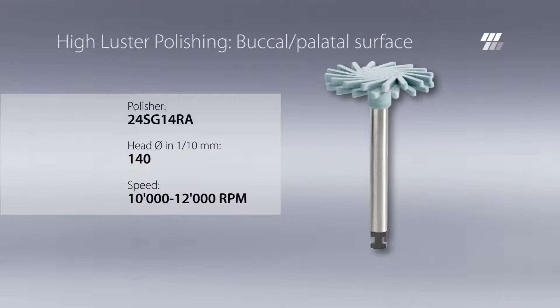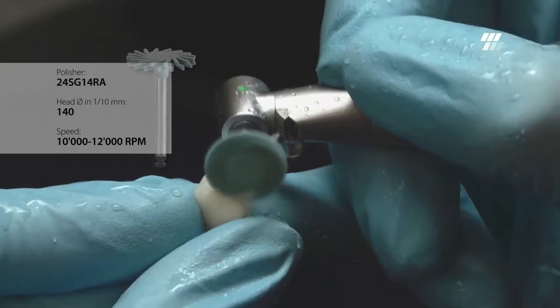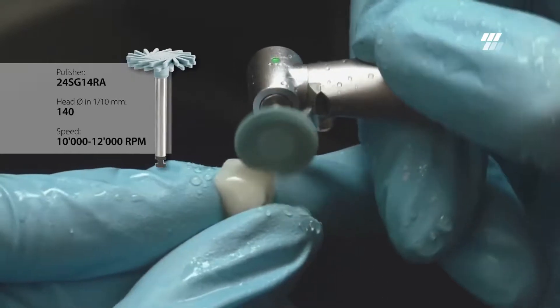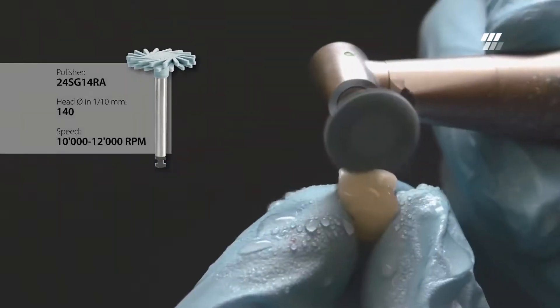For high luster polishing of the buccal and palatal surfaces, use Diatek ShapeGuard Blue with a diameter of 14 mm. Again, minimal and constant pressure should be applied while polishing. Diatek ShapeGuard achieves an outstanding high luster polishing result.